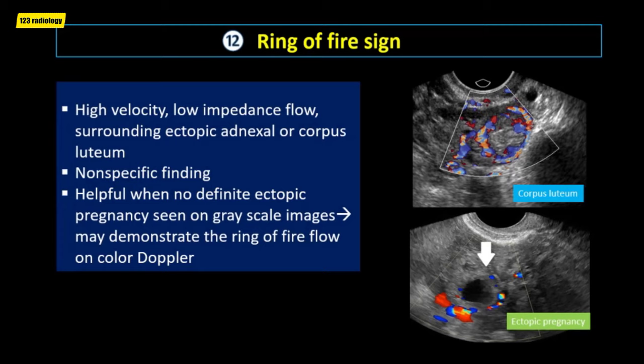The ring of fire sign describes the high velocity, low-impedance flow surrounding an ectopic adnexal pregnancy. Peripheral hypervascularity is a nonspecific finding and may also be seen surrounding a normal maturing follicle or a corpus luteal cyst. Determining whether this flow is within the ovary or outside the ovary is most important to distinguish between an ectopic pregnancy and a corpus luteum. The ring of fire sign is most helpful when no definite ectopic pregnancy is seen on grayscale images, and color Doppler may improve confidence in the diagnosis.